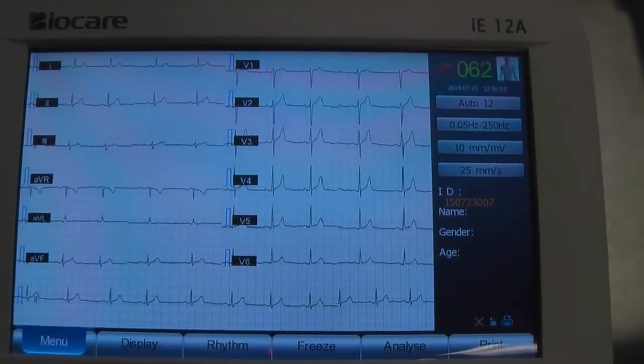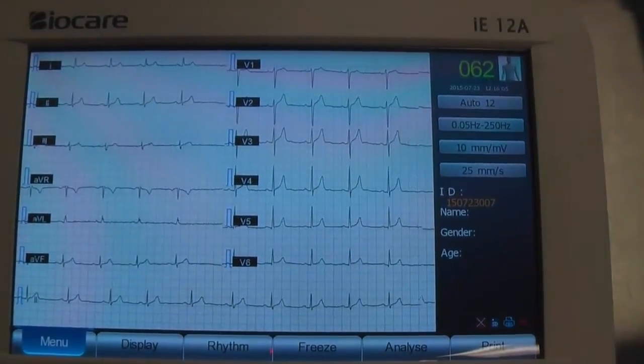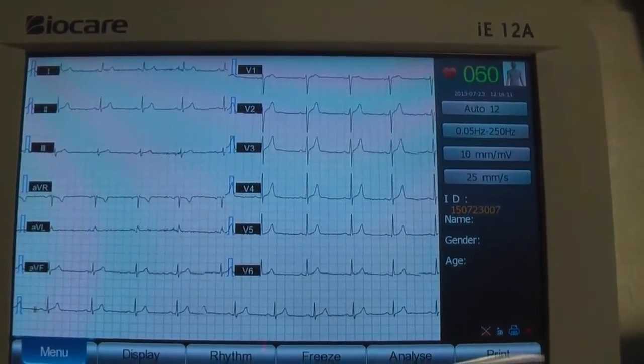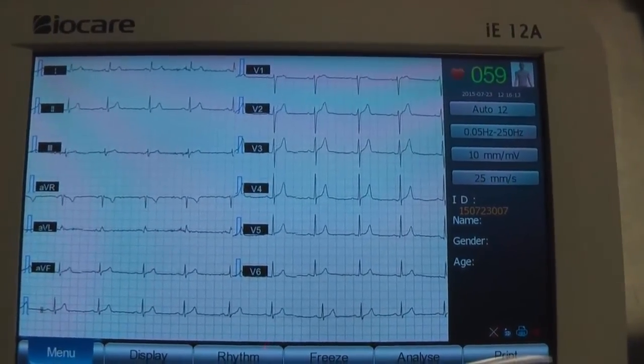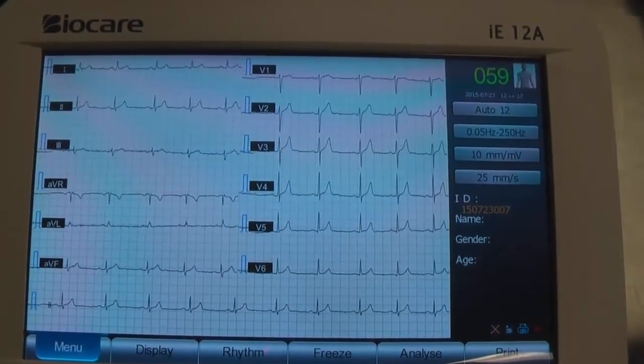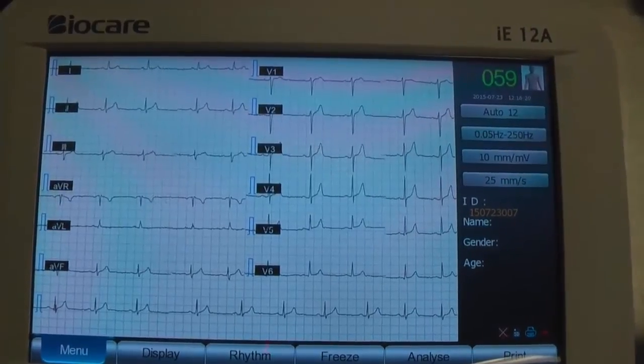This is the trace where we haven't prepped our patient at all. It's still pretty good, but we're getting a little bit of muscle artifact. We've had to adjust the electrodes to make sure they're staying in place because they've lifted, but the trace is still okay.